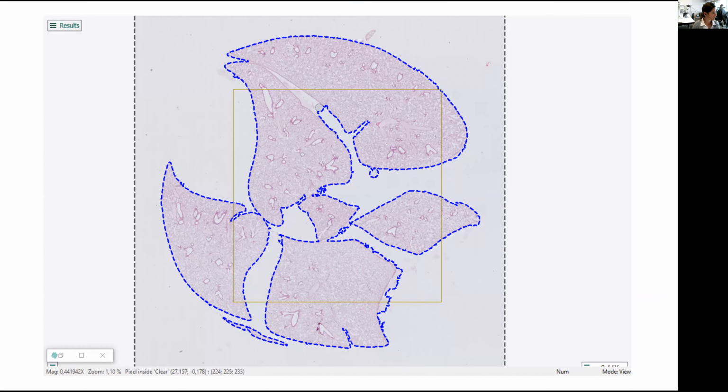So I would get something like this that's obviously working very quickly, and I can of course do all that in batches, but you can already see there are things that can be improved, and I'm still trying to figure out how much is best done manually. So basically I would go in, check all the slides, do some minor corrections, or sometimes it's actually quicker to improve some of the performance by retraining, and then I would avoid that.